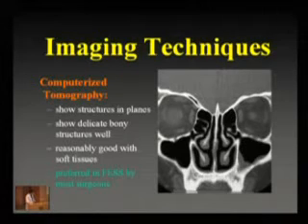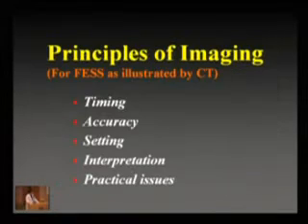And CT scan perhaps is the most commonly used imaging technique when we are contemplating FESS surgery. First of all, you can see all the structures very well, including delicate bone structure, and we can see the structures in a planar perspective. There is also reasonable tissue density when we manipulate the window of the CT scan settings. That's why it is preferred by most FESS surgeons nowadays.